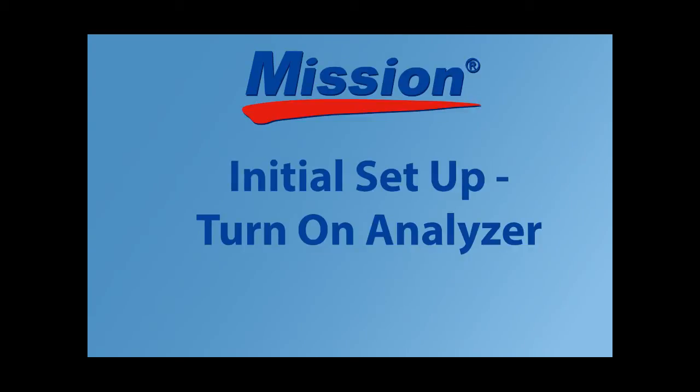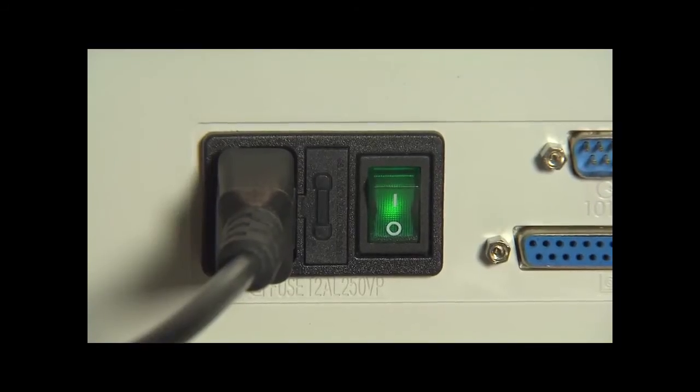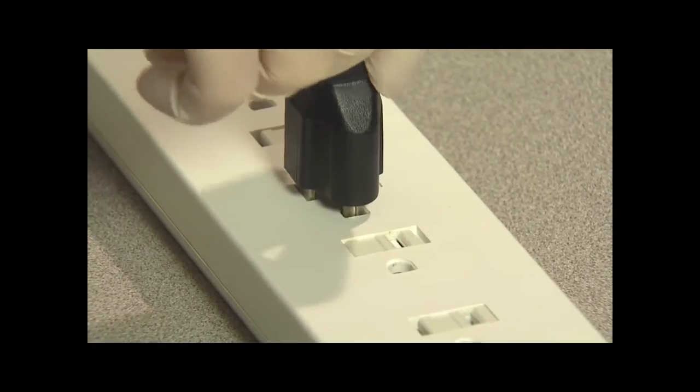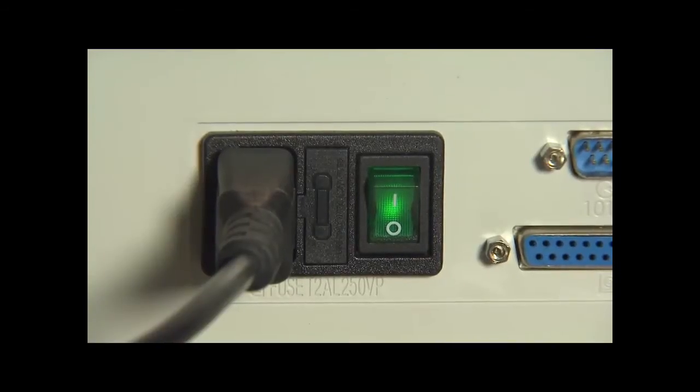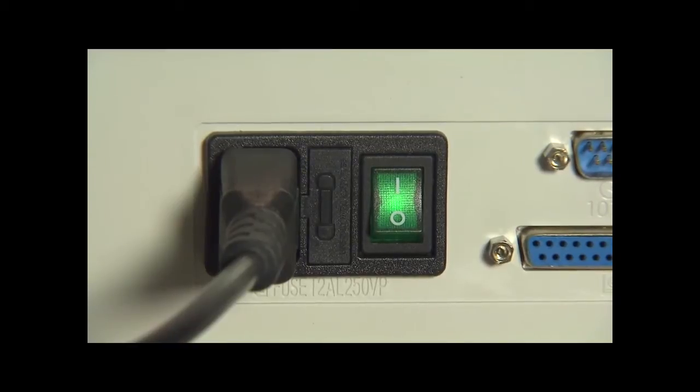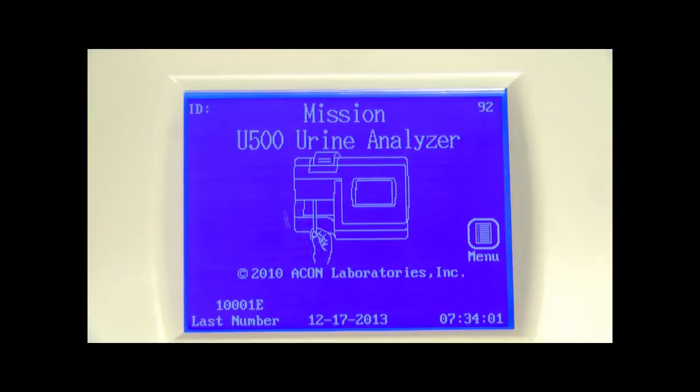To turn on the analyzer, connect the power cord to the analyzer power connector and then into a suitable power outlet. Then press the power switch located on the back panel to turn the analyzer on and initiate the automatic self-test. If you are using the barcode reader, make sure you install it before turning the analyzer on. If the automatic self-inspection passes, the initial screen will be displayed, indicating that the analyzer is functioning properly.